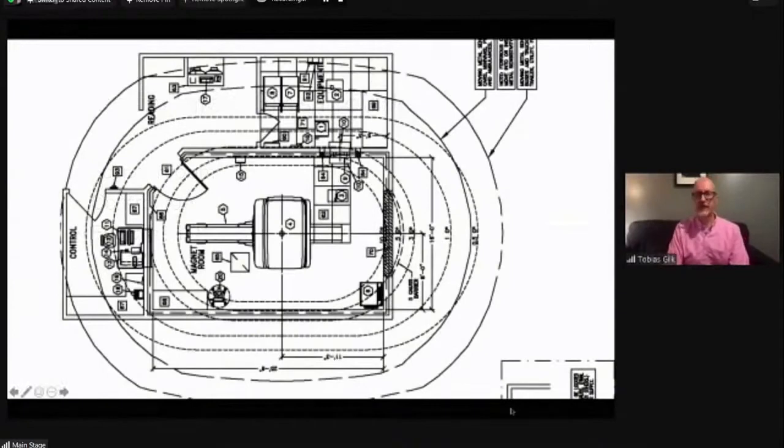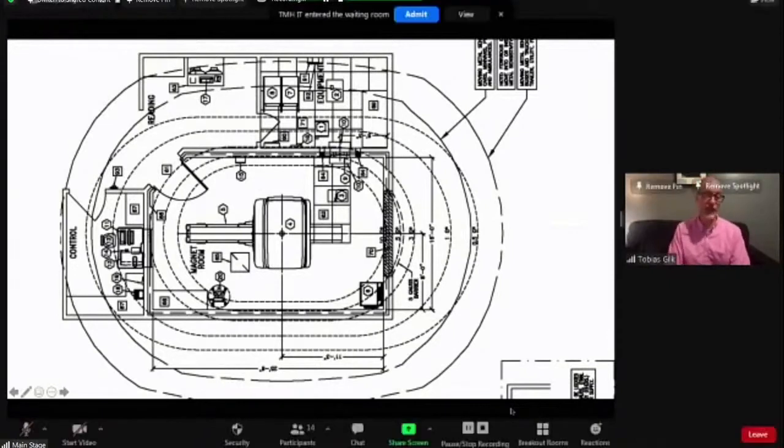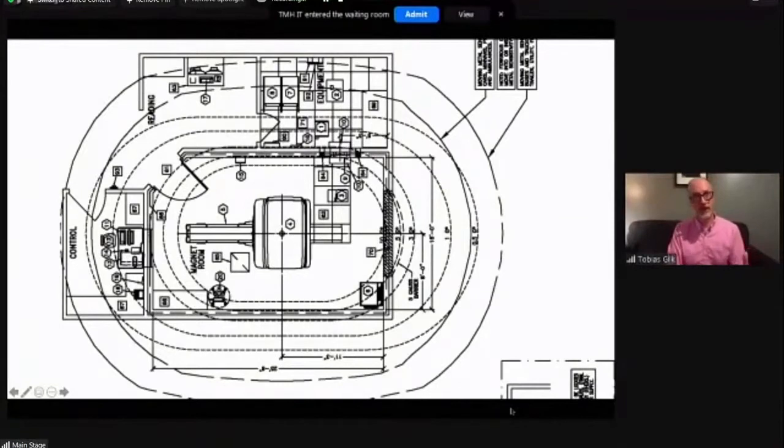This is an illustration. This is a prototypical floor plan from GE. I don't mean to pick on GE in particular. Every one of the manufacturers has some different version of this that depicts the control room, operator's console, radiographer's console, the scanner room, and then the system component room. This particular layout, I suspect that GE over time was just able to shrink their equipment room and they repurposed previous prototypes. And so they just squeezed in a reading station into the leftover space.